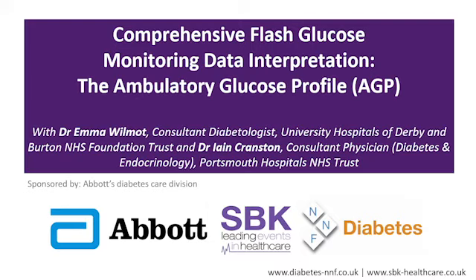I think the power of looking at the AGP is that almost everybody treating themselves with insulin, which is the majority of people using CGM devices at the moment, unless they're self-purchased, is thinking in the moment about now and the next 4 to 6 hours and what the decision-making process is. The difference with looking at the AGP is it allows you to step out of that merry-go-round and say, this is what I've been doing. Is it working? And is it something I would like to change?